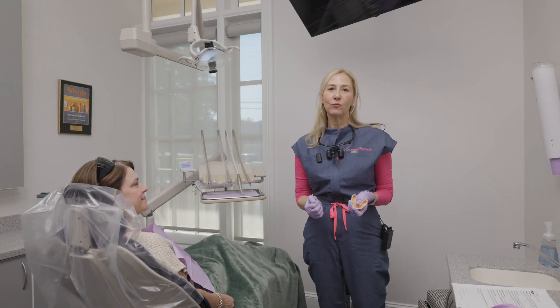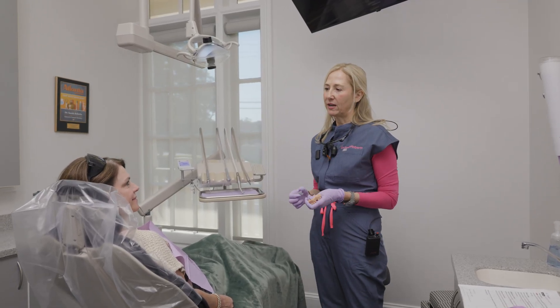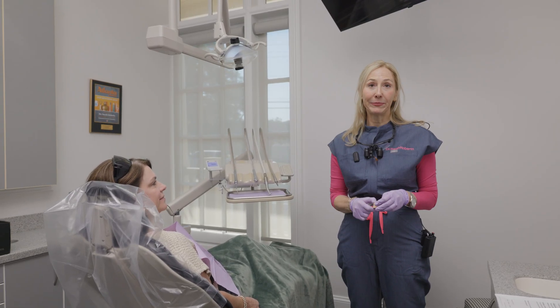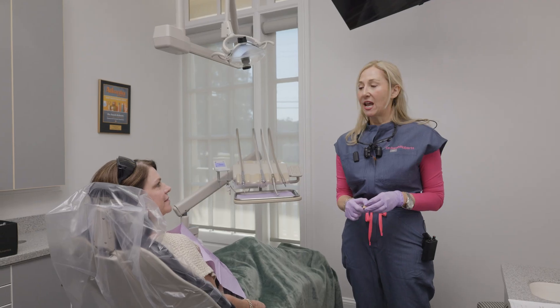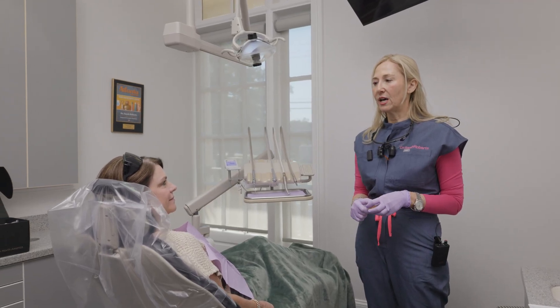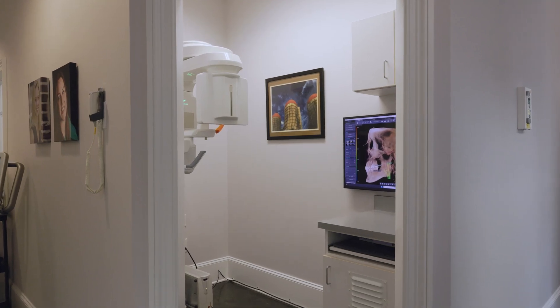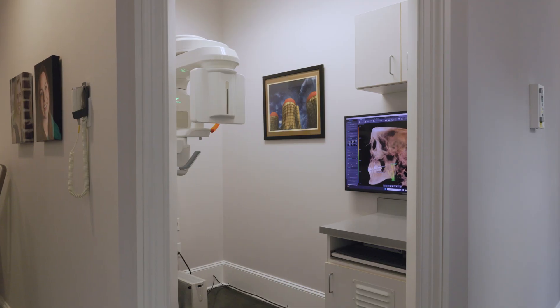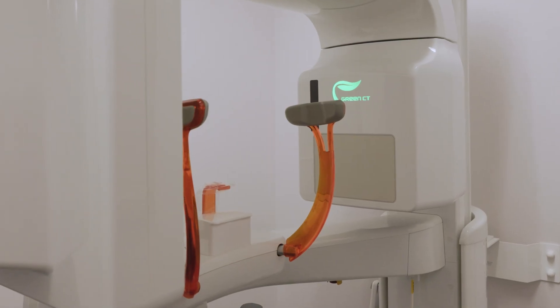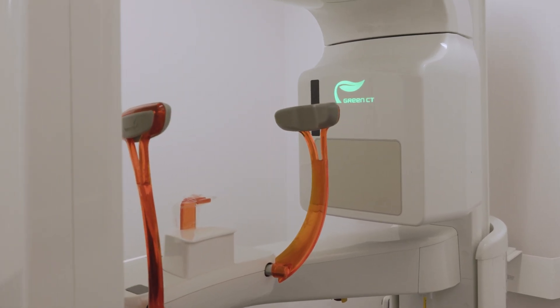We have Robin here today and we are talking about implant placement and how we utilize all of the special new technology to have optimal implant placement.